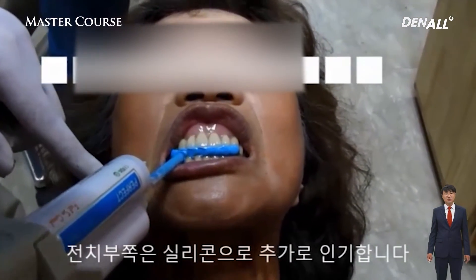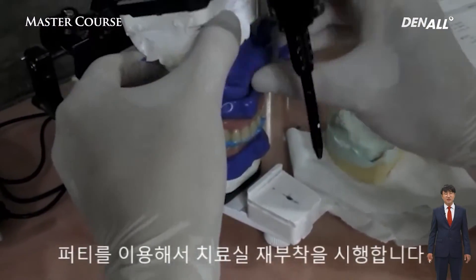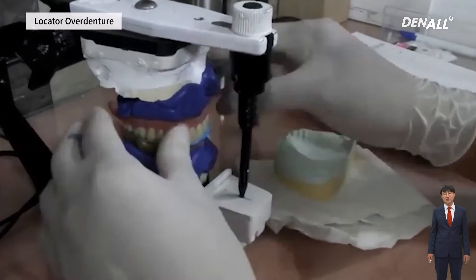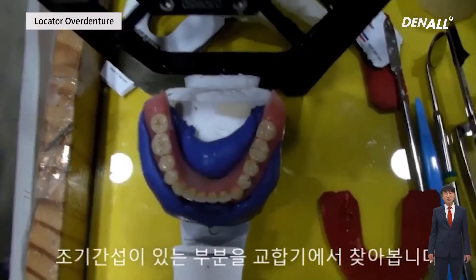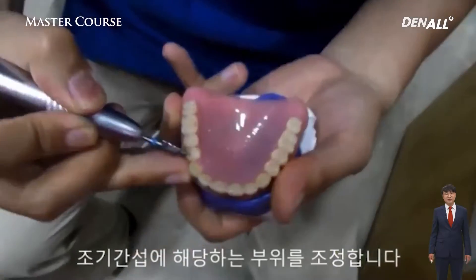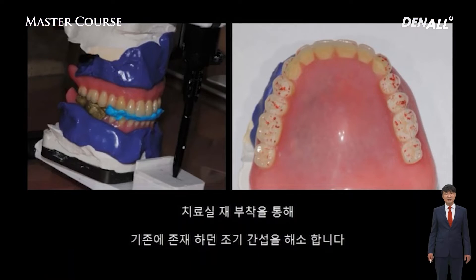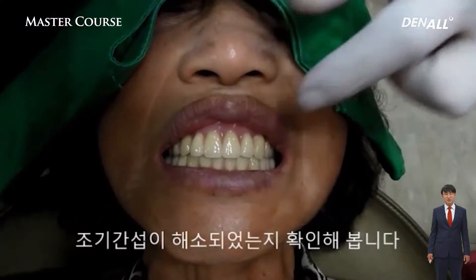On the anterior side, I use silicone. Using putty, I think putty is the fastest because it has minimum damage to the denture. If there's interference, you can see it really clearly on the articulator, so I remove that. By reattaching at the chair side, I make sure that all the problems are solved.